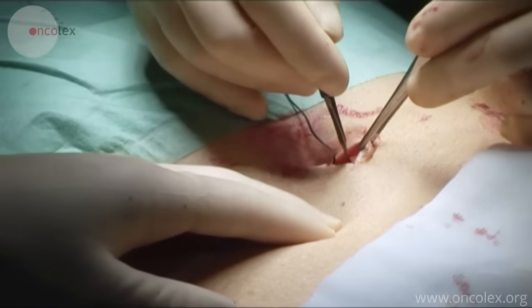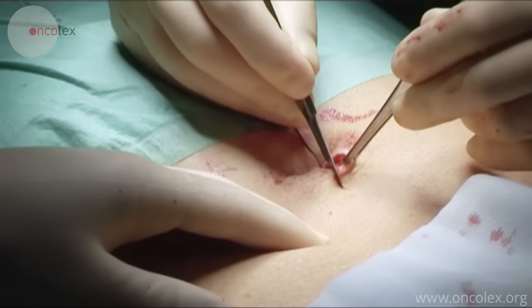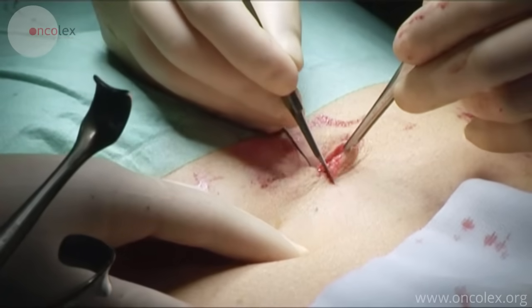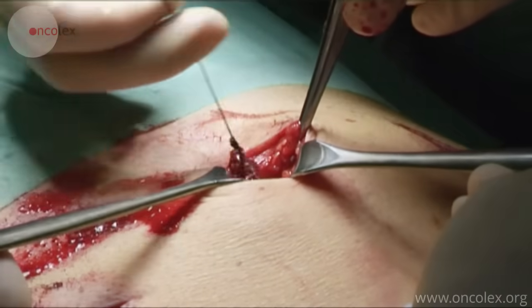Here is the incision in the umbilicus where the plastic bag with the specimen is removed. While this is being done, the nurse dismantles the robot and prepares it for the next procedure.